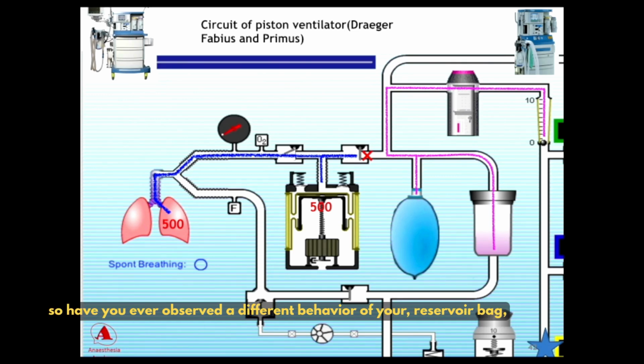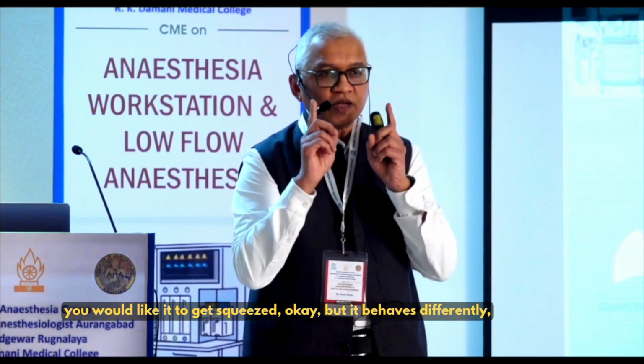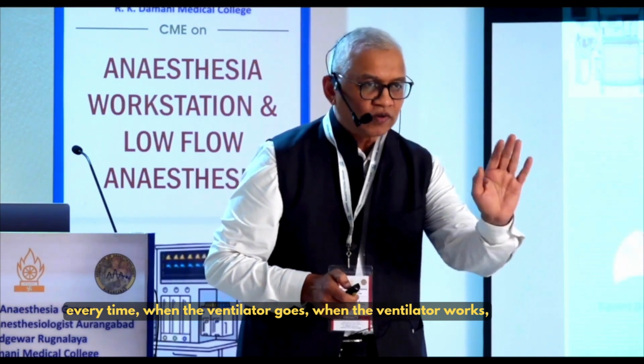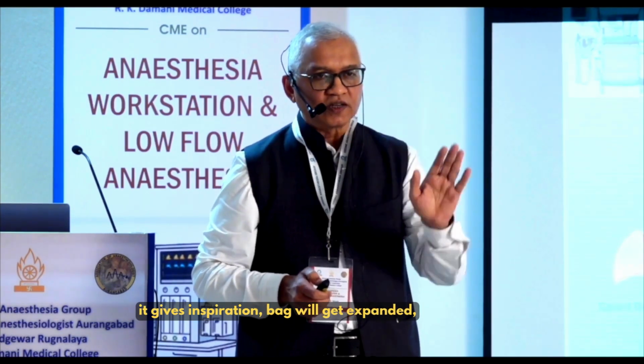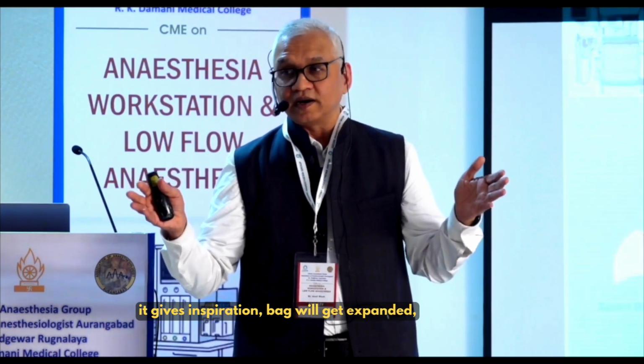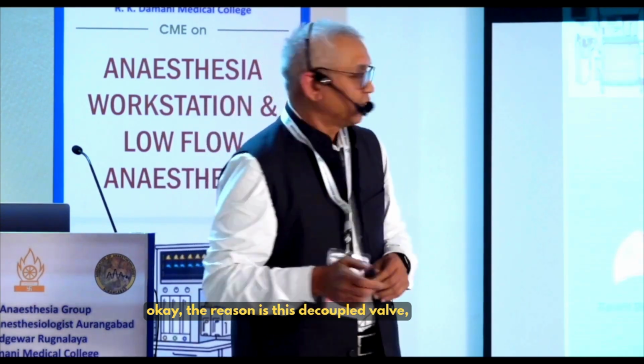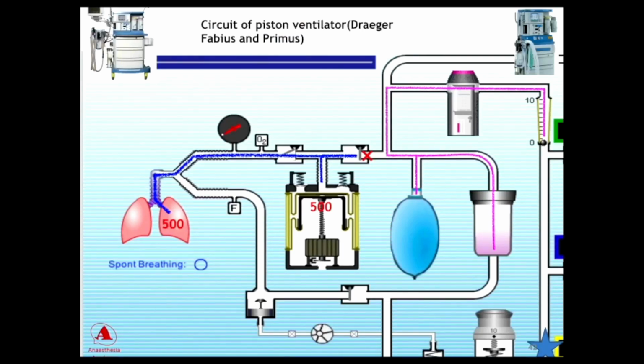Have you ever observed different behavior of the reservoir bag in a Dräger machine? It will inflate in inspiration. You would expect it to get squeezed, but it behaves differently. Every time the ventilator works and gives inspiration, the bag will expand. That is opposite to our conventional thinking. The reason is this decoupled valve.